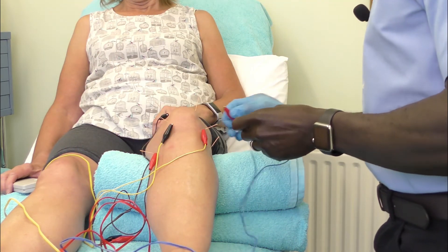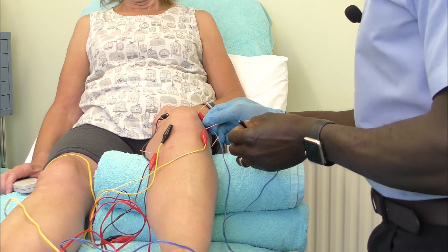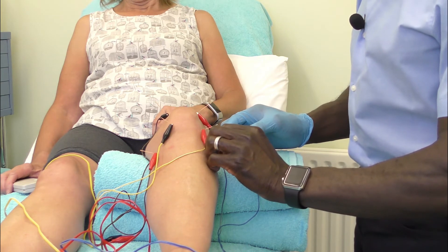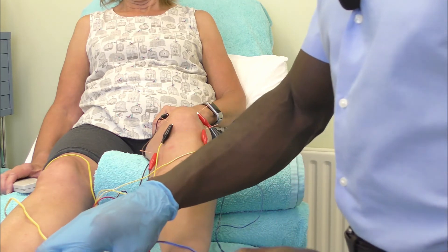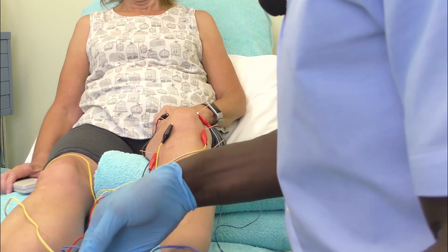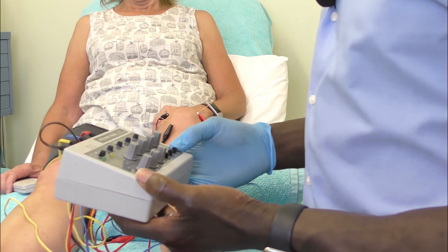Now, key thing is there are other points you can utilize in addition to these, but you don't want to go for the overkill with all the points. I'm going to set the device to 20 hertz, particularly for the OA knee, or anything between 10 and 20 hertz.